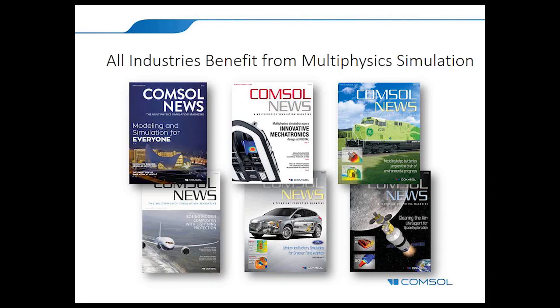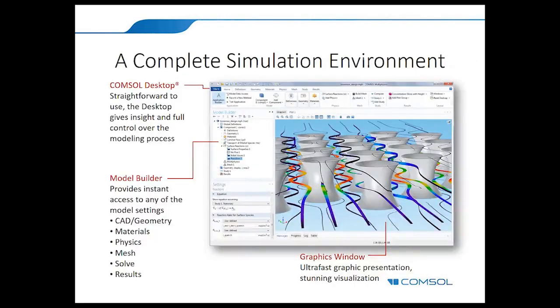Now, let's explore the COMSOL desktop. Our interface is quite straightforward to use, where all the modeling steps are readily accessible and any settings can be edited as needed. You can do this in the window referred to as a model builder, then input or select your custom settings in the window just next to the model builder, and then visualize your results in the graphics window. Clicking on a specific physics node in the model builder allows you to view all relevant parameters and equations in the settings window. It's also possible to evaluate and couple several model components in the same file.